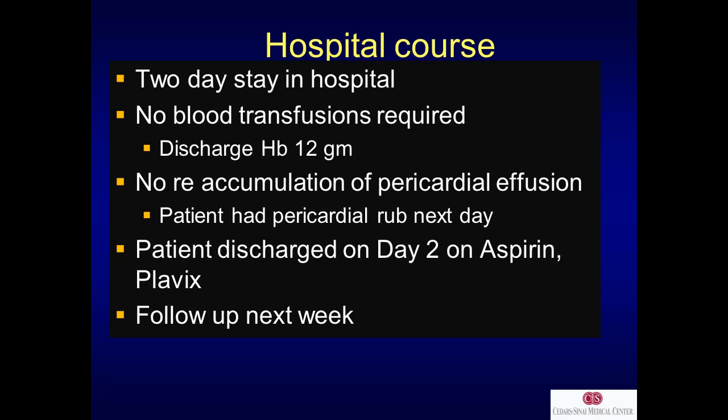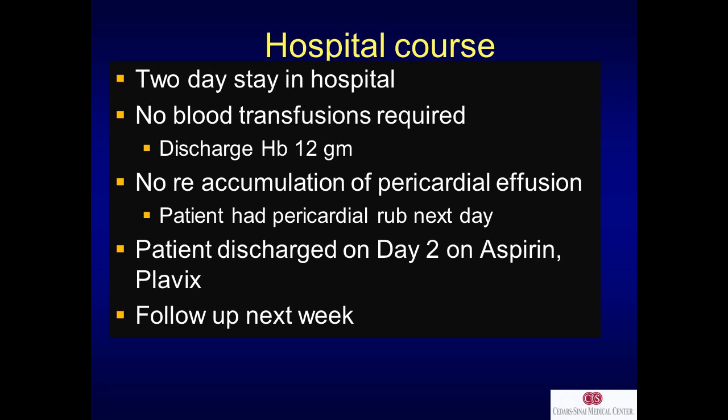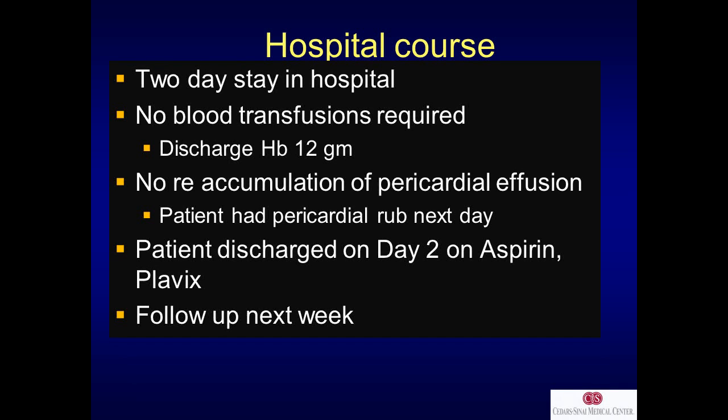No, it's the balloon, because this is very friable tissue. It's really friable, because think of it, this is from a burn, repeated burning. So it's very friable. It's not the wire. I think it's just a tear of the wall, and that's where it happened. In some of these cases, we've seen a post-mortem case when we were in Cleveland. That area becomes almost like parchment-like with that repeated burning.